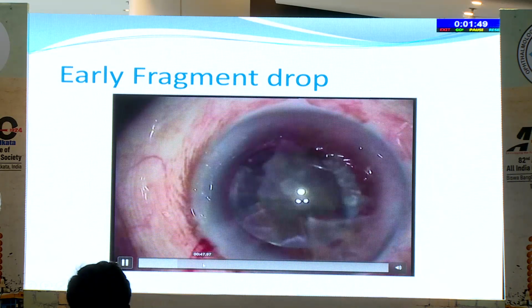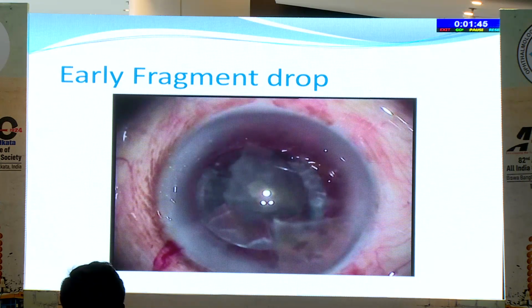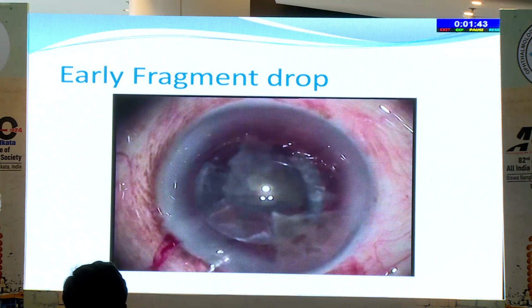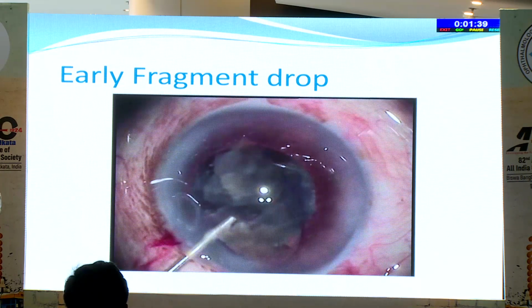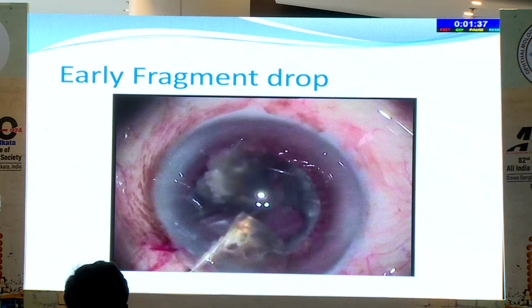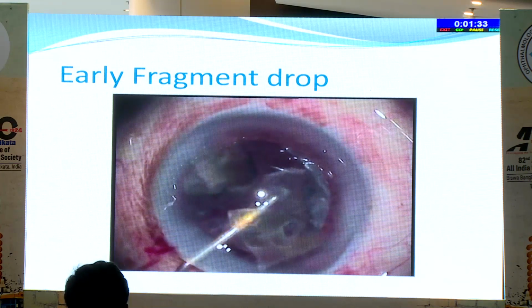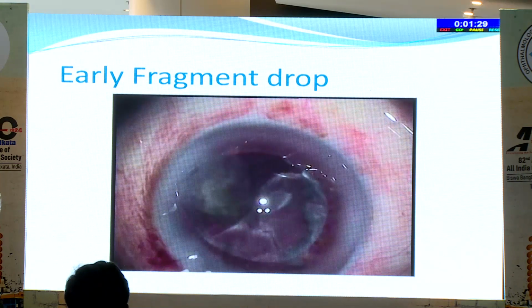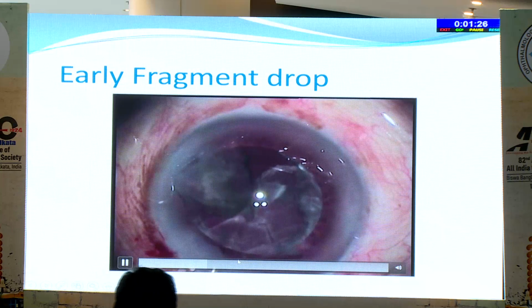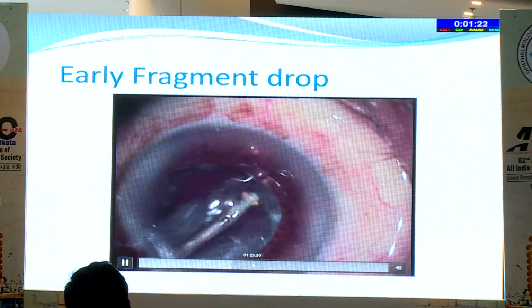Okay, now, take a deep breath. Come out, block it with visco. Try to visco express as much as possible, and always when you don't need bubbles, they come. That is Murphy's law. So then Ocuvisc becomes Aerovisc, as Dr. Matthew would say. And then try to remove as much as possible. Visco express, do vitrectomy whenever it is necessary.